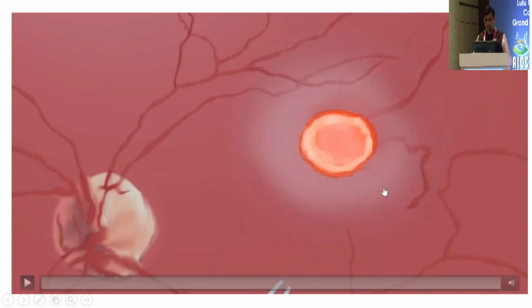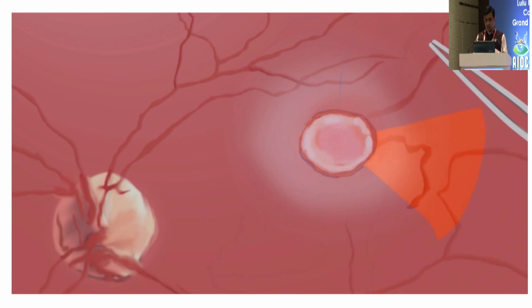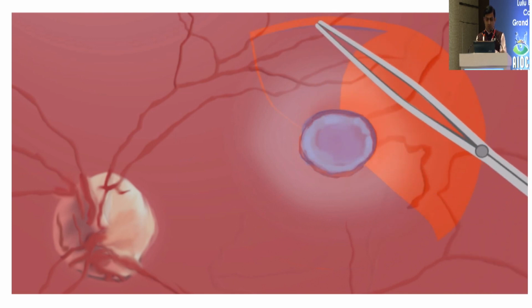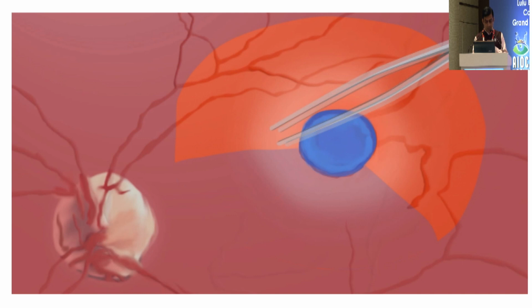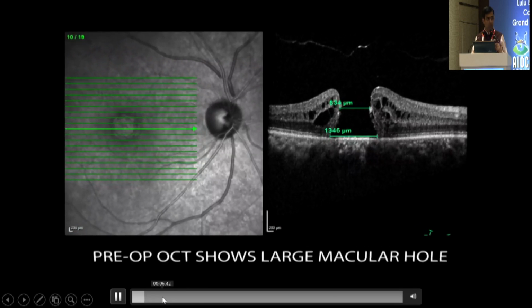So quickly, I think this was the one technique which even Vishal was also doing, and we call it multi-layered ILM peeling flaps. The only advantage is we have lower flap dislodgement rates, as previously described by Mikulivska. They had around 14% flap dislodgement. So I'll just run through the cases.